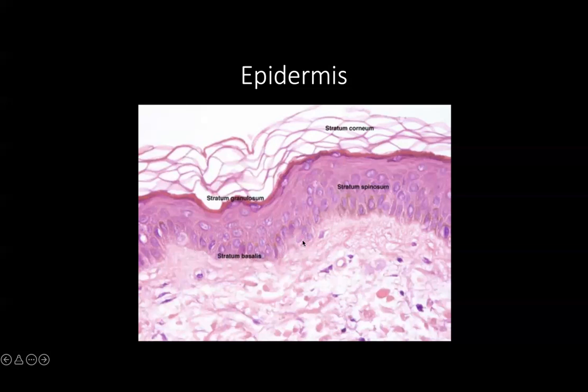So here's another, for example, here's another. And each melanocyte actually has dendrites that touch and deliver melanin pigment to 36 keratinocytes. So it's pretty networked here. The epidermis is very complex, and it's got a lot of intercellular communication and networking happening. Now, of course, if you think that I'm going into a lot of detail, that's because I'm a cell biologist. So I really love the cellular aspects of dermatopathology. That's how you make sense of what you're seeing.